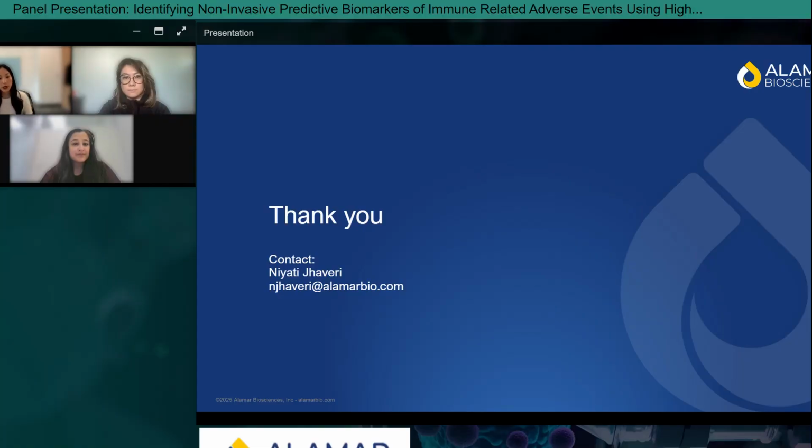So if you were to extrapolate this backwards and use a TLS signature, or maybe just a marker within TLS, let's say CXCL13, theoretically, you could use Alamar and NULISA to check these levels from the beginning of treatment, because you're able to detect pg/mL over time and see that the levels are going up. And this could be done way earlier than you can see changes on imaging.